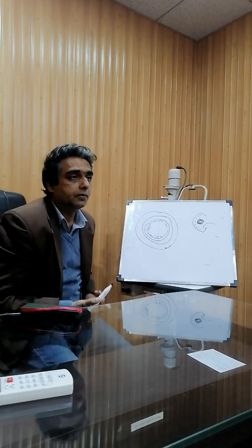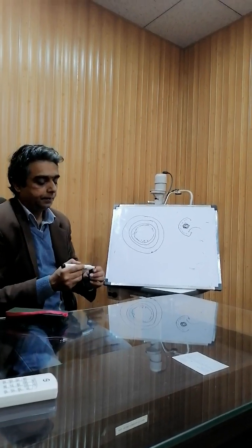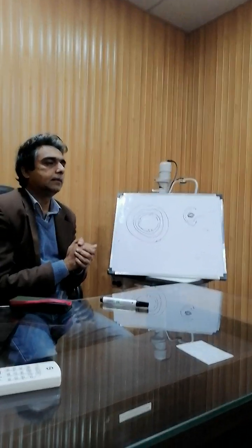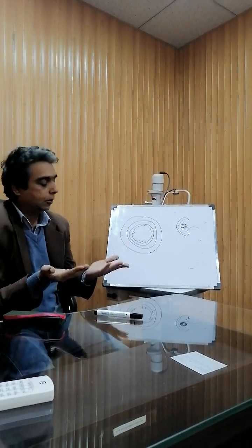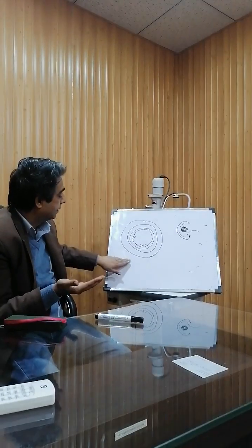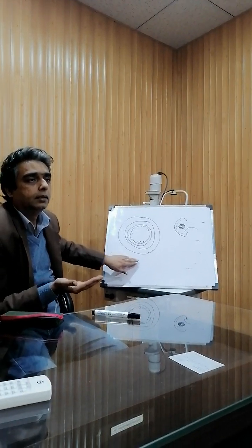an intraocular lens which is injectable or foldable. A normal lens diameter is 5.5 to 6.5 or 6 millimeter. For that we needed a large incision, but this is a very small incision.